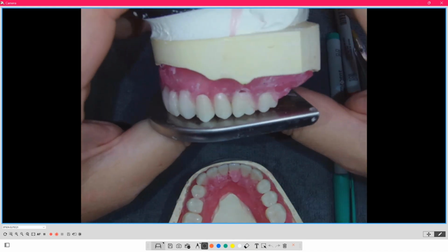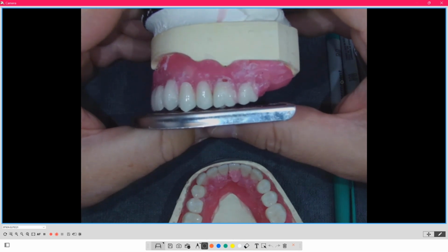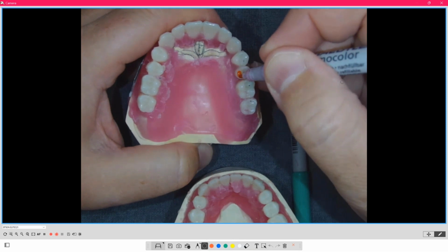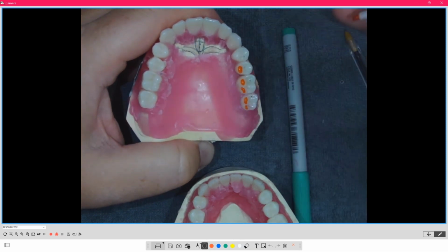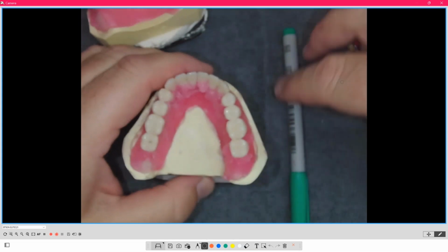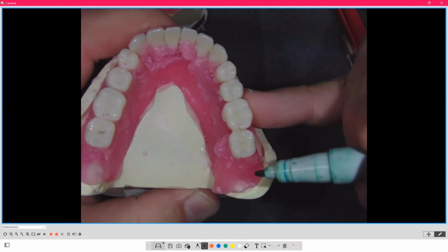So again, the way they set up is very similar to what you're used to with 20-degree teeth in terms of the placement. Just what you notice on the tooth is that it has that larger lingual cusp. So that's from that mortar and pestle approach. Those are the cusps that are going to mince and break down the food, and that is held by the lower. So the lower is shaped more like a bowl, again, like the mortar and pestle.